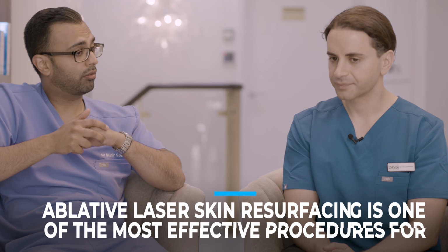Yeah, absolutely. Like with anything in what we call regenerative medicine, you're causing specific damage to promote wound healing. So you're harnessing the powers of your body to essentially improve. One of the benefits that I have with CO2, in comparison to our microneedling video, is that CO2 not only stimulates collagen, but it also resurfaces through ablation.